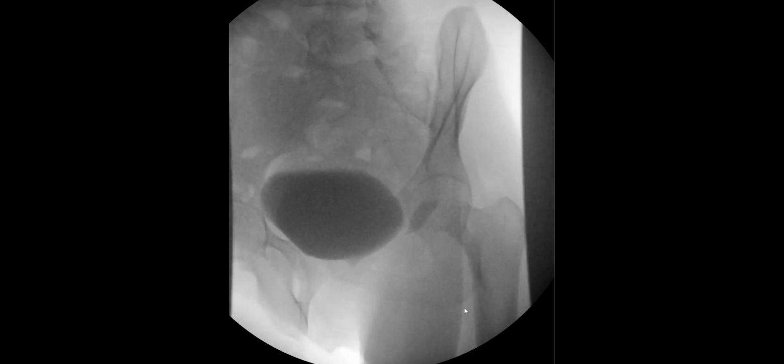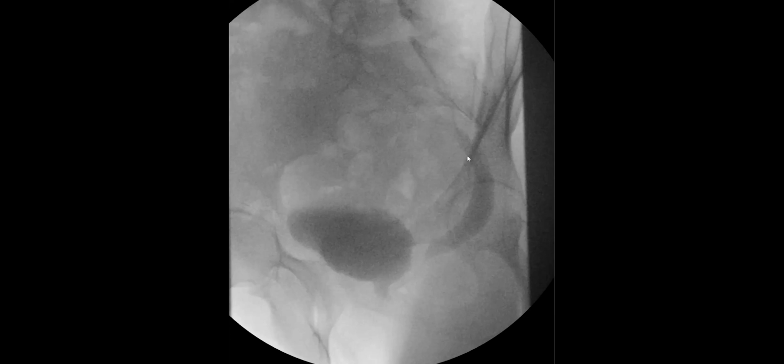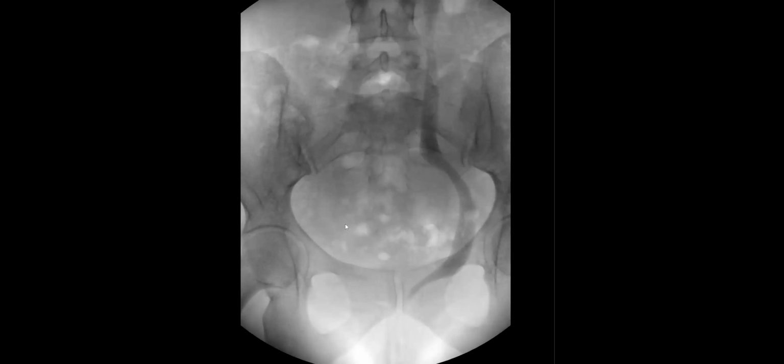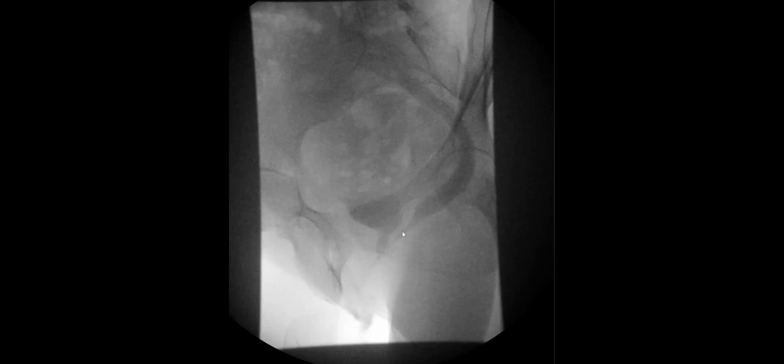And as you can see, because this was a left-sided recurrent UTI, we positioned them so that we can demonstrate the left ureter better if there is reflux. And as you can see, there is something that is filling up. As they keep voiding, the column of contrast that extends cranially keeps going up. And here you see contrast opacifying the collecting system or the renal pelvis, and the entire left ureter, even after the bladder is completely empty, is opacified. And actually, when we went back and looked carefully at where this ureter inserts, you can see that it goes down and inserts into the urethra.